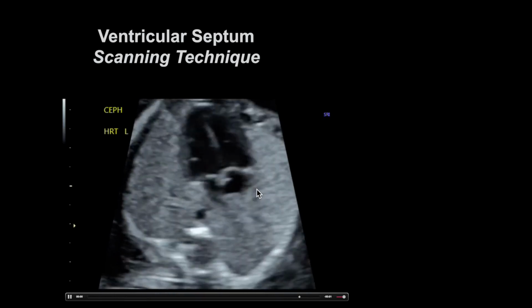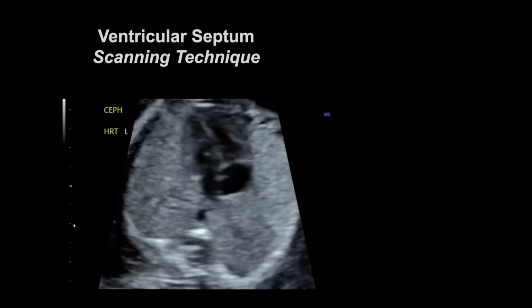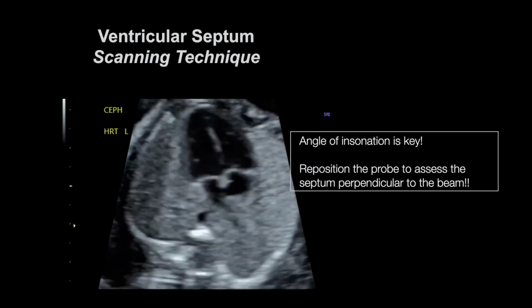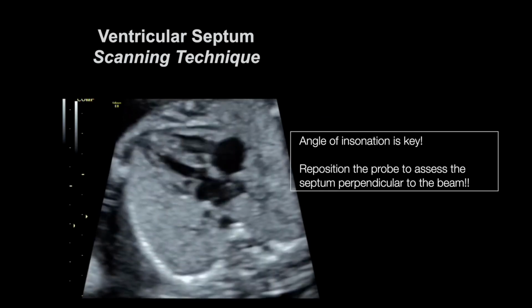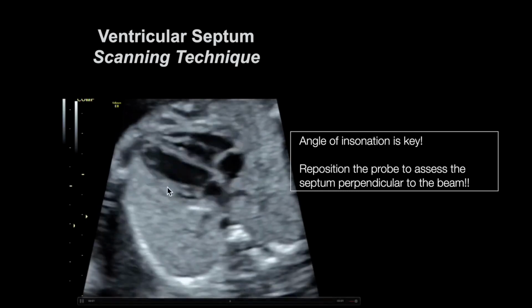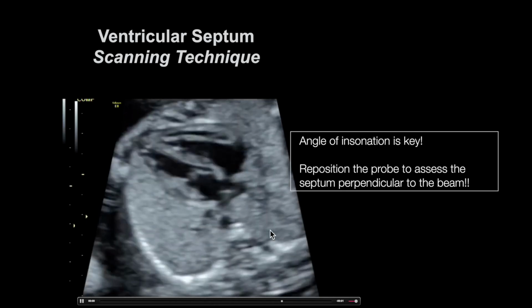So what you want to do when you see this potential area of dropout is you want to just adjust your angle of insonation or reposition your probe to come in more perpendicular, or at least at an angle. It doesn't have to be perfectly perpendicular to the beam. And now we can see that this area underneath the AV valves looks intact with 2D.